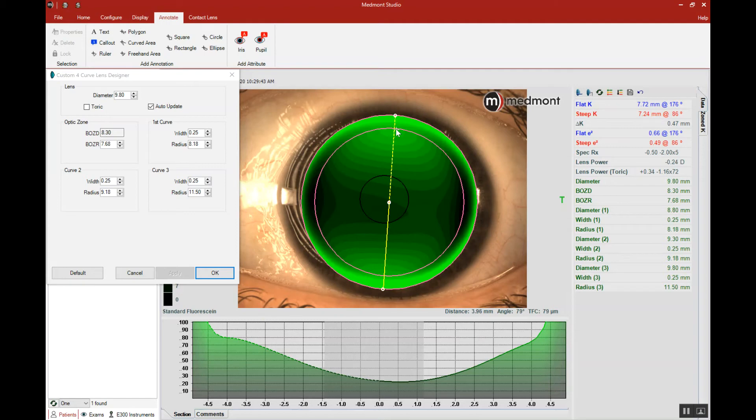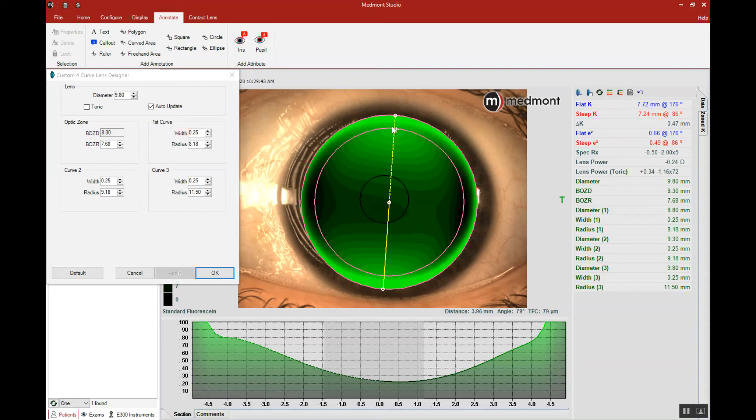In previous sessions we've explained that around 40 microns of fluid at the edge of the optic zone, right here, would be about the maximum that we would want to accept. Any more than 40 and the lens is going to rock back and forth a significant amount. It may be unstable, it may struggle to be centered and comfortable.